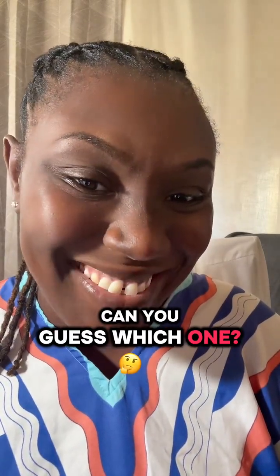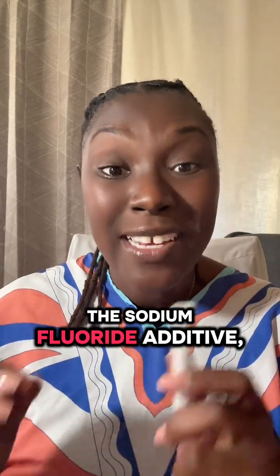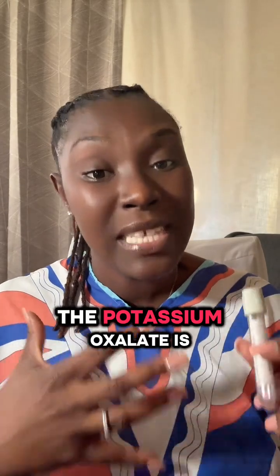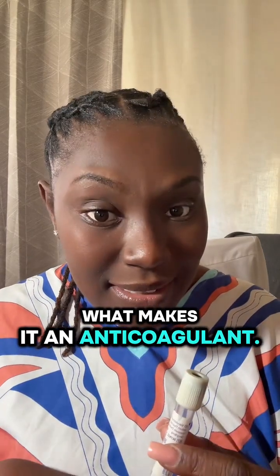Can you guess which one? It's okay, I'll tell you. The sodium fluoride additive, that portion, is the preservative for glucose. The potassium oxalate is what makes it an anticoagulant.